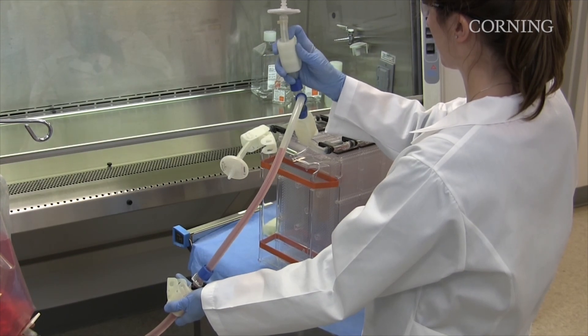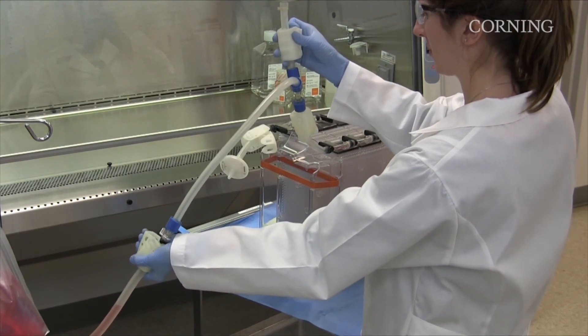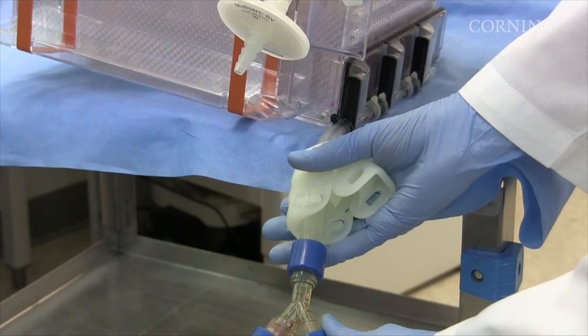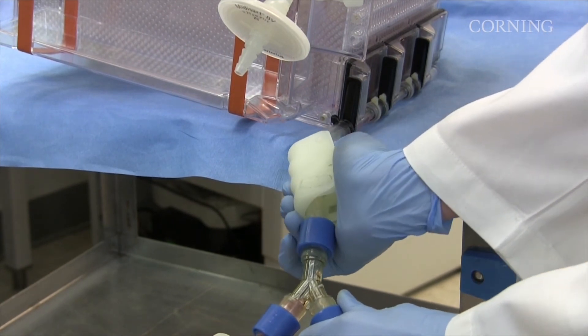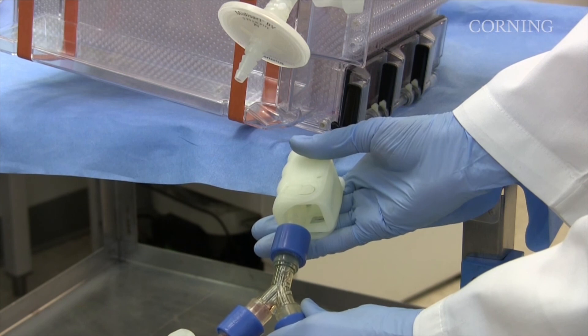After the HyperStack vessel and liquid handling tubing are empty, the vessel can be turned to equilibration position and the tubing lifted to chase the media. Close both the clamp on the liquid handling tube line and the clamp on the collection vessel tubing. The procedure is now complete.